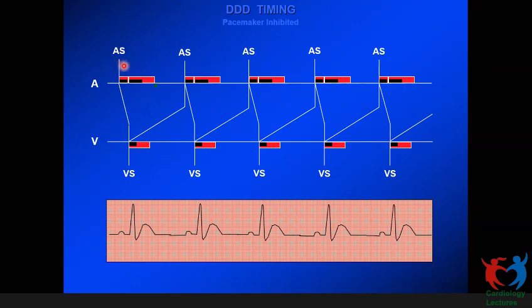On sensing, it starts an AV interval. Before the AV interval expires, AV conduction happens, so the ventricular intrinsic activation is sensed. Note here, on a sense in the ventricular channel, there is no blanking. The blanking in the ventricle kicks in only when there is a pace, the post-atrial ventricular blanking, because the atrial sense event, an intrinsic P wave being sensed in the ventricular channel, is very, very rare. So that is not incorporated. That happens only on an atrial pace.